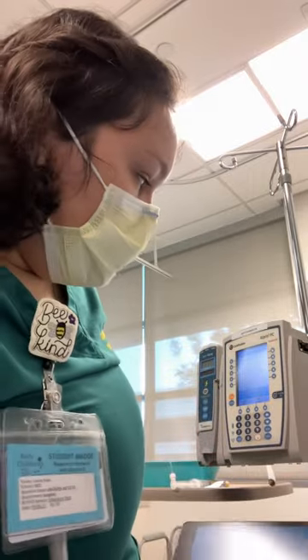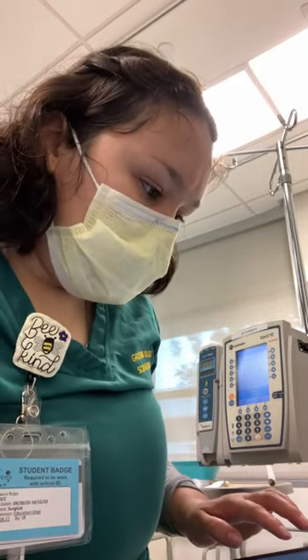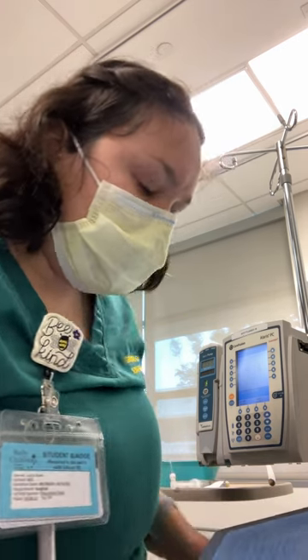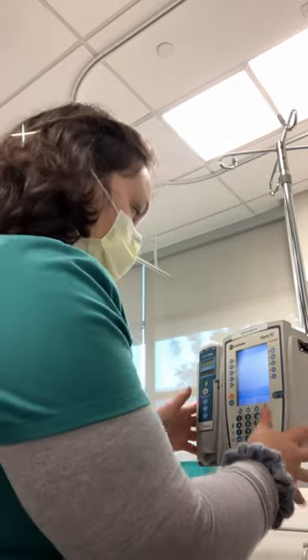I'm making sure to ask if my patient has any allergies — she doesn't. I'm also doing my patient identifier. I have Jennifer Ning. I'm checking the medical record number and date of birth. And I want to check the IV site first.